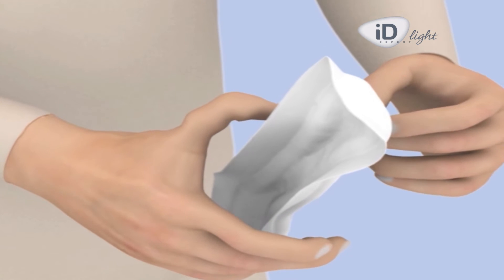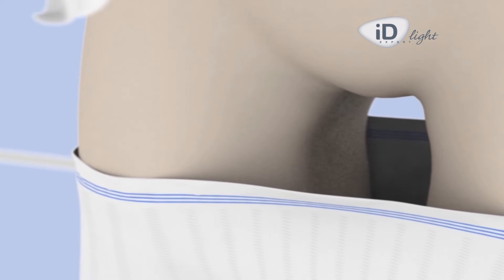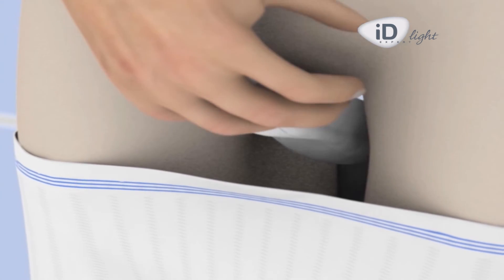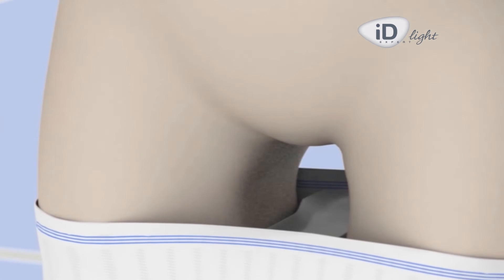Remove the adhesive strip from the product and position the product centrally in the crotch area of the undergarment, so that the urine will make contact with the most absorbent area of the pad. The adhesive part should be in contact with the underwear to ensure the pad remains in place.